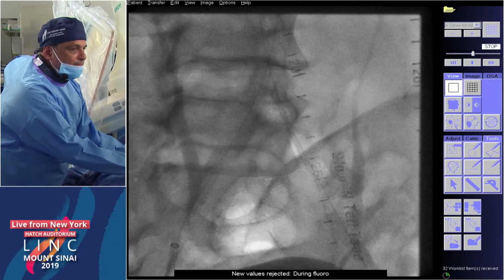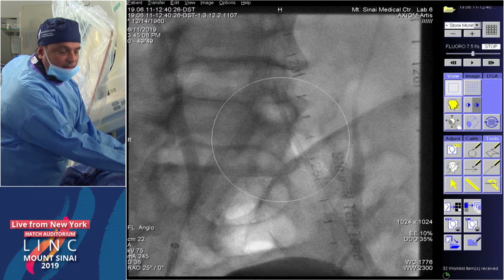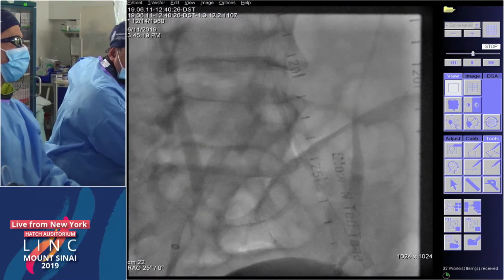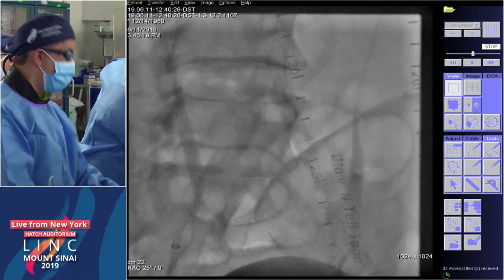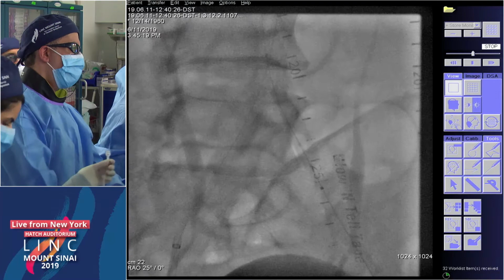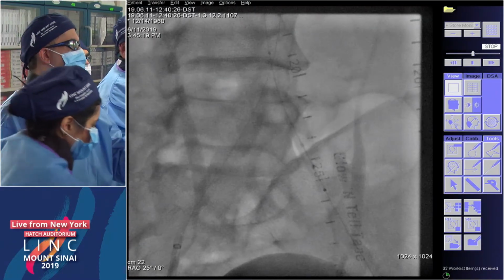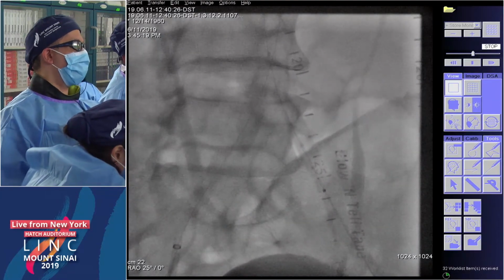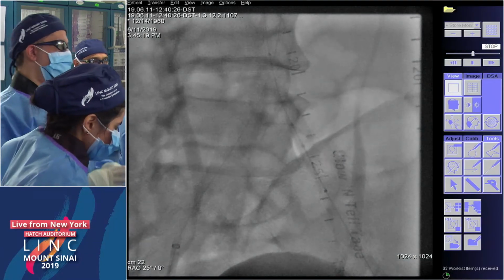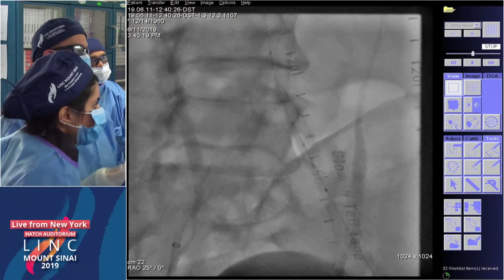Yeah. So Shockwave is pretty much like lithoplasty. So it essentially has the waves which are generated through the balloon. So the idea is to prep the balloon up as if it's coronary, and you inflate the balloon up to 2 atmospheres opposed to the walls, and then you start the Shockwave treatment itself for 30 seconds. The centermost balloon is the most prominent where the waves come out and have the maximum effect. And as you go down to the edges, the effect of the waves itself is lesser. And you go for 30-second cycles. And every balloon lasts for around 6 cycles.